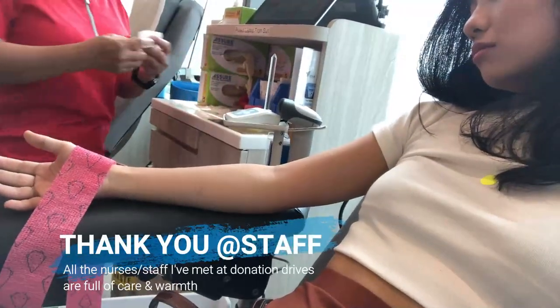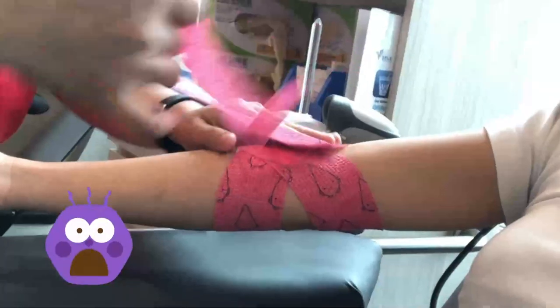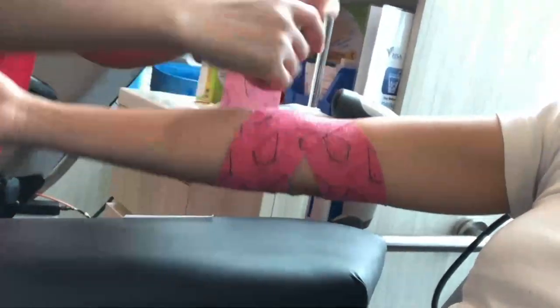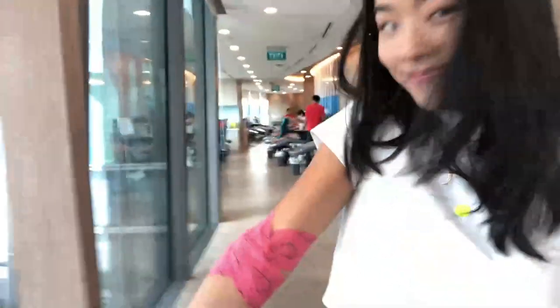This very kind nurse is going to help bandage my arm, and you should not take off this bandage — if not, your blood's going to start spilling out and it's going to be nasty. Don't take out the bandage until a couple of hours later. You can take it out, just not so fast because blood really does come out.